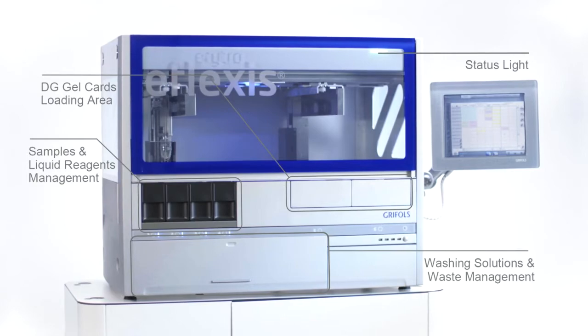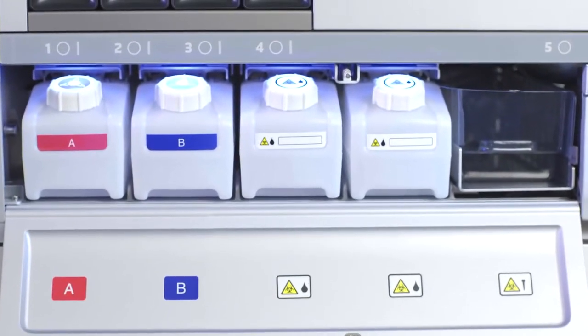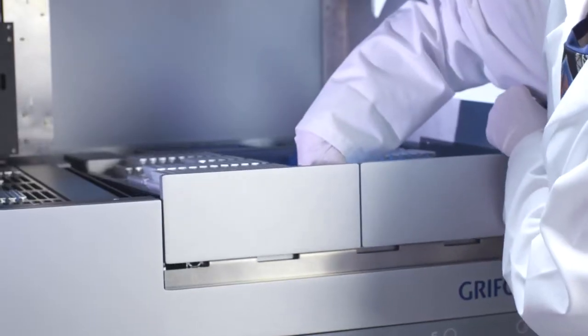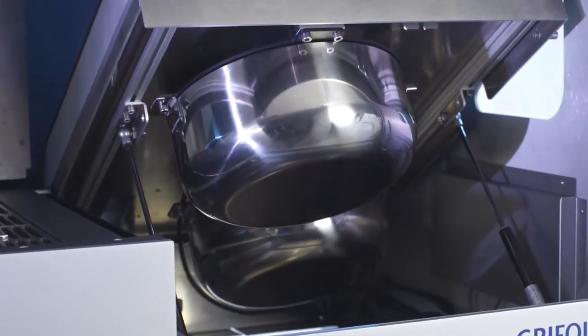The system features a process status indicator light. Washing solutions and waste are managed at the bottom. The two centrifuges are on the right side in the card area.